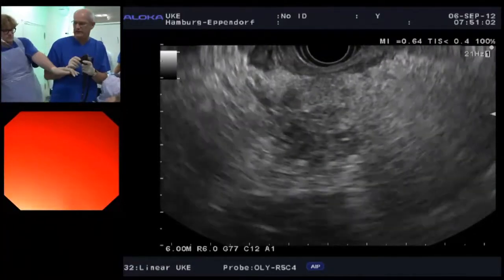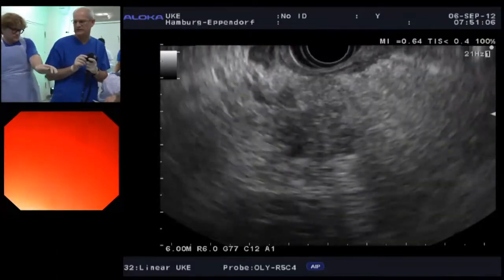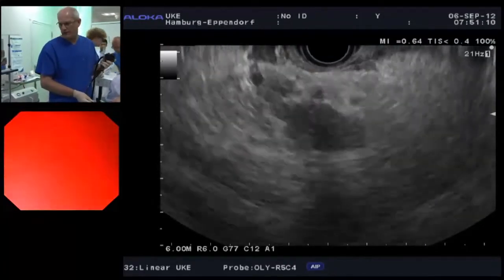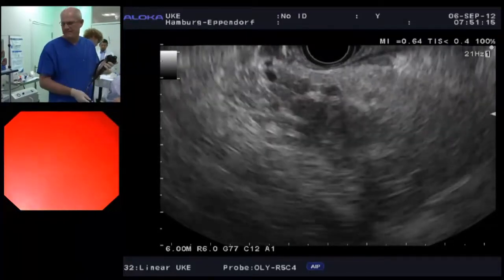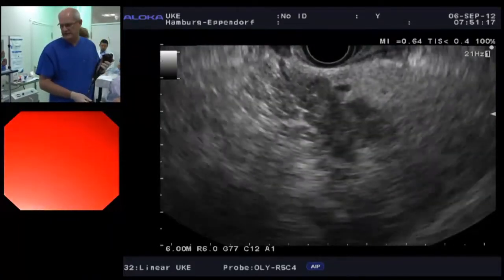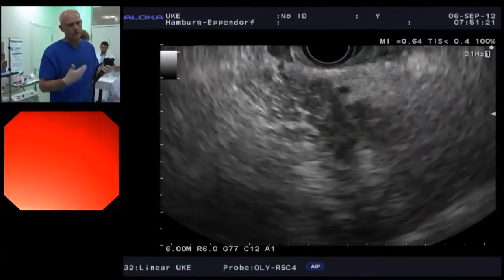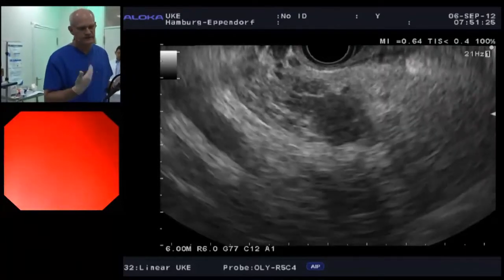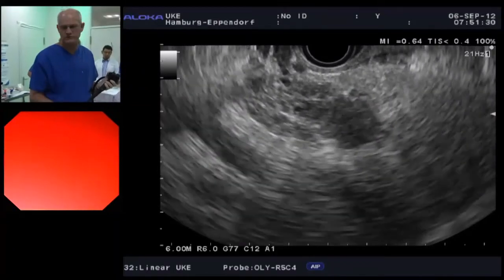I don't, Mike. I think we'll take a look at what this biopsy shows. If this is negative and we're just not seeing anything at all, then I will reapproach that celiac artery. But I tend to believe that you're right, that this is a pancreatic head mass that has sort of crept along the celiac artery. Regardless, if this turns out to be tumor, it's unresectable with the arterial invasion that we've demonstrated on EUS.